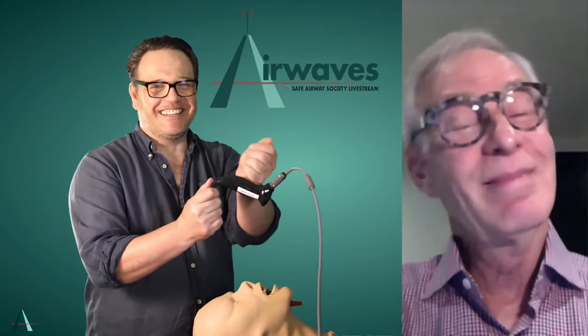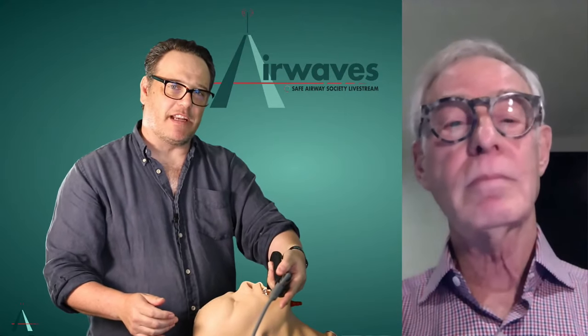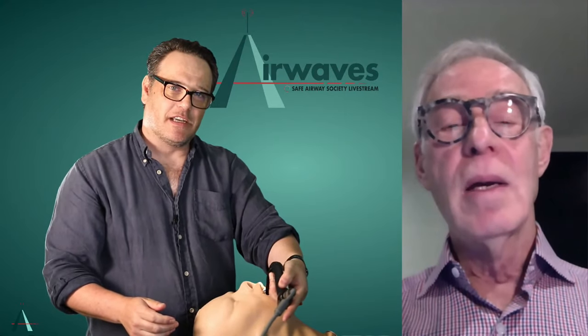So I'm not sure if that's the same thing as a Kessel modification, but this is a problem that's pretty uncommon. So I'm not sure that there's a need for that kind of modification, but it's something I had thought about myself. Don't you like the name sickle blade? You know, I'm all about the language. In that situation, you can just put the blade in sideways to avoid that. That's what I used to do.